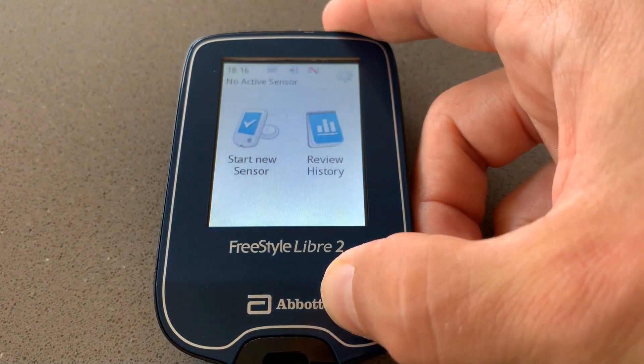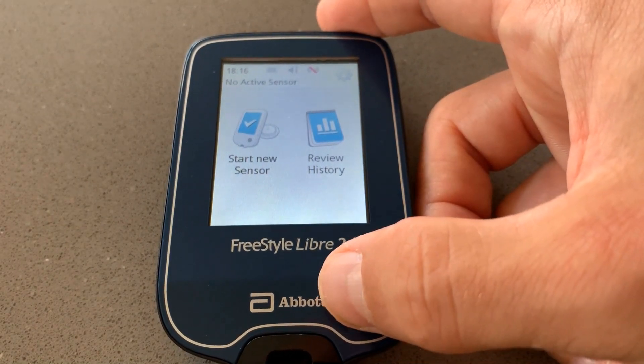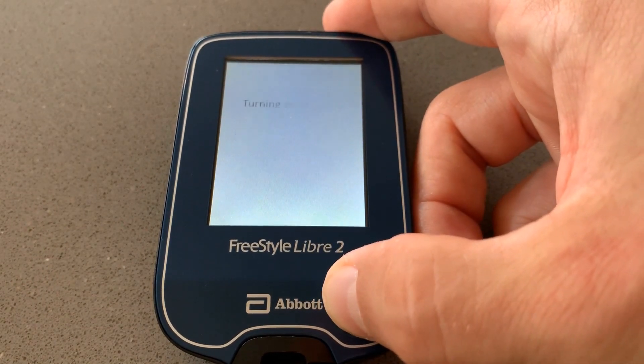Tip number one: get the most out of your Freestyle Libre reader. Every time you want to switch off the reader, just double-press on the home button. This is the fastest way to do it, which saves almost half of your battery life so you don't need to charge so often — help save the planet.